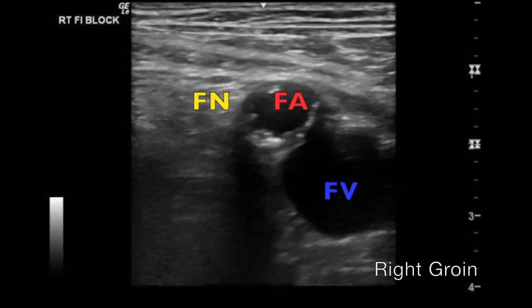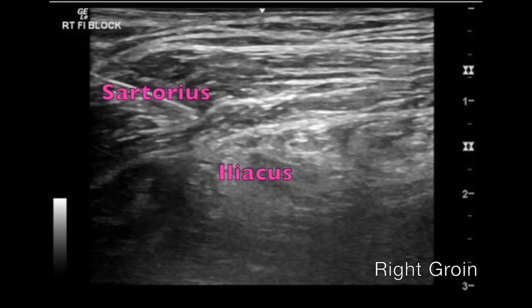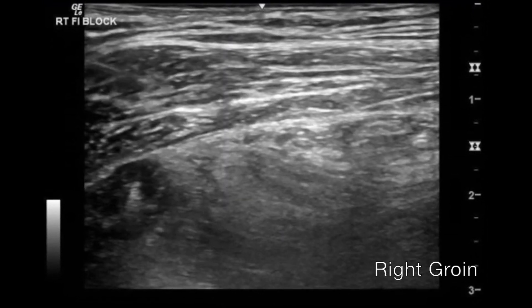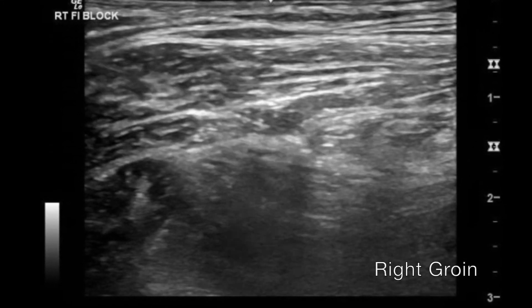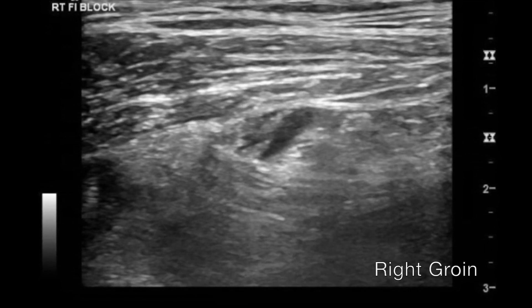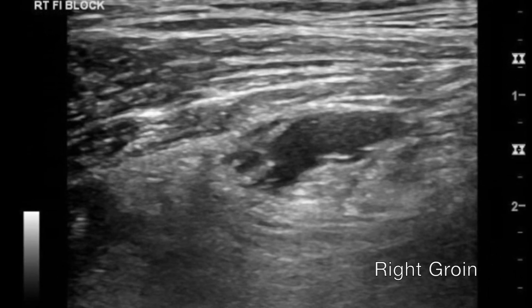Now we'll demonstrate a block being performed on the right groin. First, identify your femoral artery and femoral vein, then move out laterally until you identify the sartorius and iliacus muscles. Identify the fascia iliaca, and with your needle slowly approach it. Once you think you've popped right underneath the layer between the fascia iliaca and the iliacus muscle, inject a 0.5 to 1cc test dose to confirm you're in the right area. Once you see separation of layers, continue to inject the remaining 20 to 30cc's of bupivacaine.